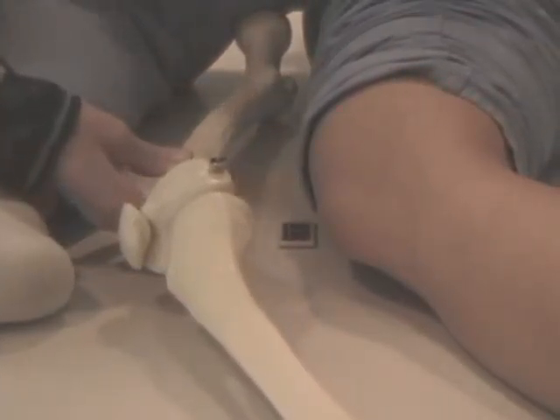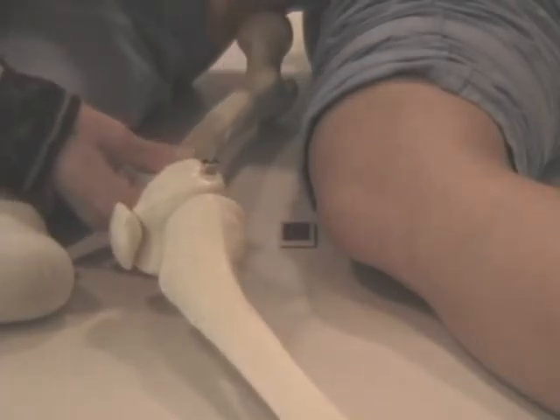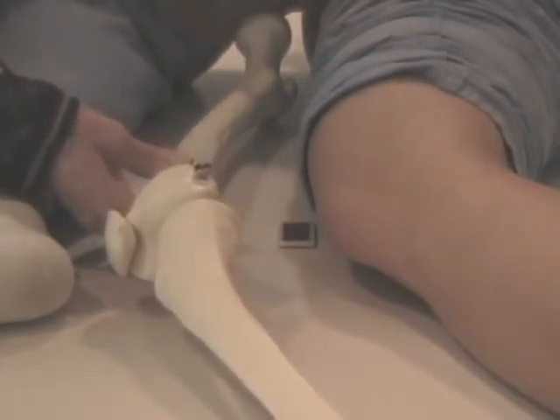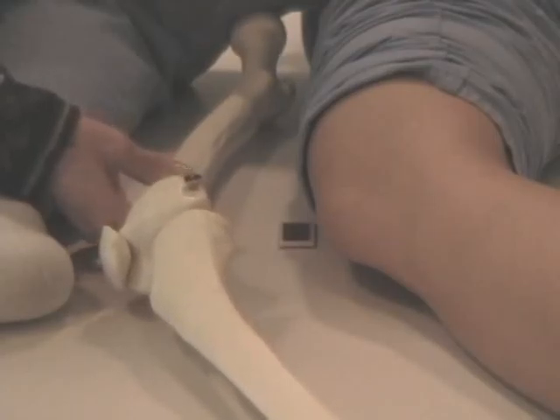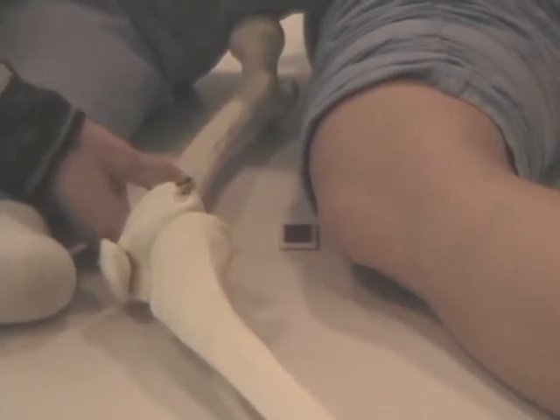Hopefully this setup, this imagination here, will help you get this concept set into your brain. Now that we finished the lesson of the AP and the lateral knee, a lot of departments only do a routine AP and lateral of the knee, but we're going to continue with this segment and demonstrate a patella. So I am again going to let the camera pause while we reset the room up, and we'll be back.